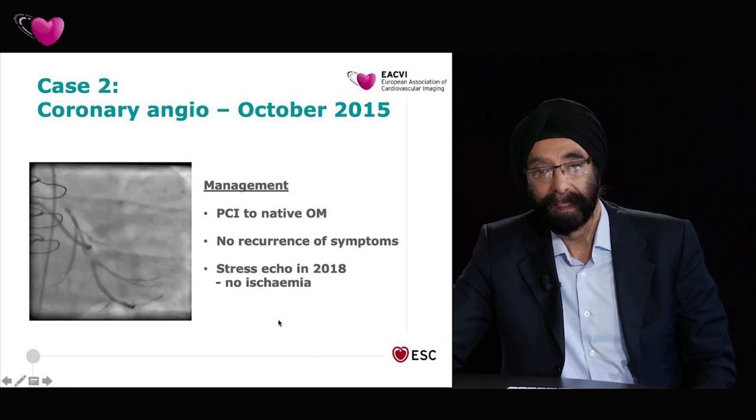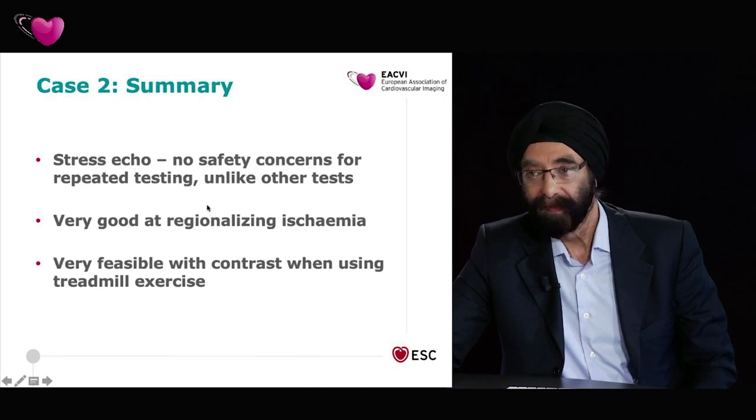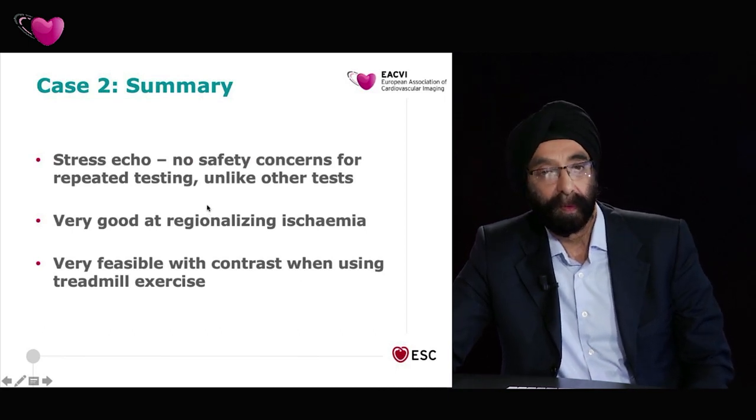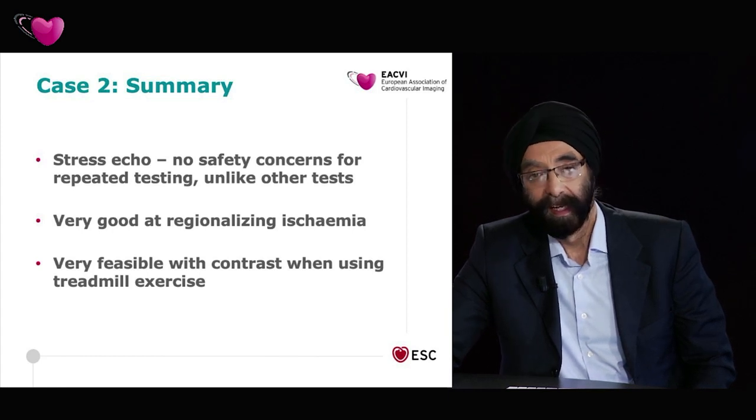So this case points out that really there are no safety concerns with serial testing with stress echocardiography or indeed with the use of contrast. And that is unlike many other tests.